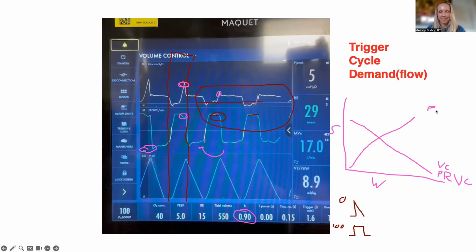And I guess one of the Hamilton modes, like ASV? Actually, don't put it there because it is technically a PRVC-based mode. So technically it would do the reverse. I'm just going to do PAV and NAVA because that's the classic stuff. But the one that's just the same is the normal pressure stuff, so pressure support and pressure control.